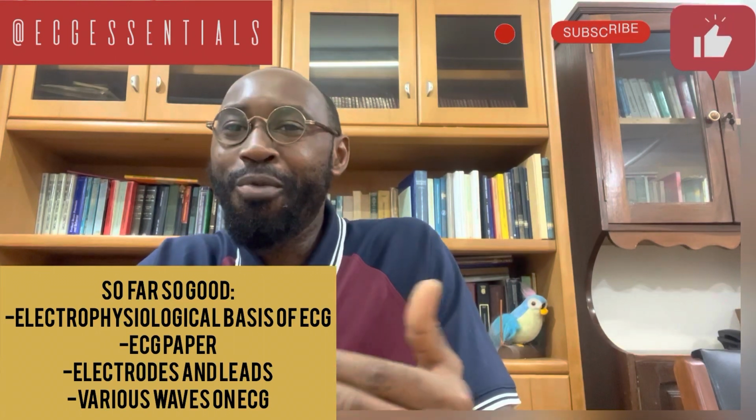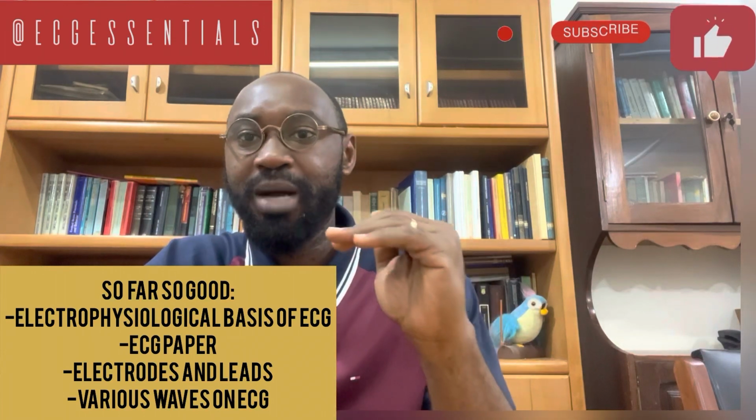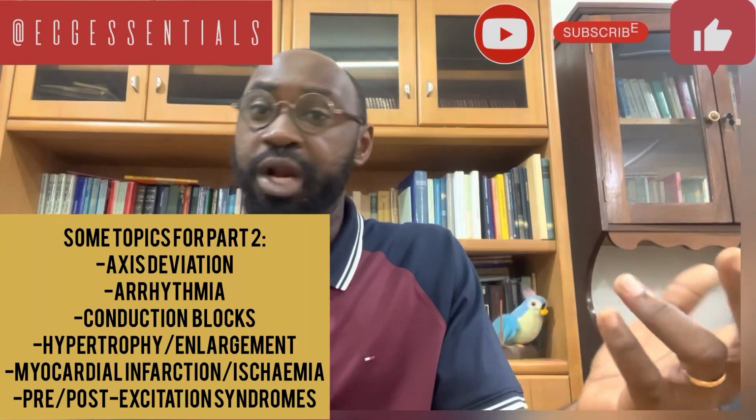And we are almost close to the second session of our discussions, where we will be looking at various abnormalities that are commonly found on the ECG, and we'll be discussing these under specific topics. So very soon in part 2, as I'm talking about, we'll be discussing concepts like axis deviation. We'll be looking at arrhythmias, both supraventricular and ventricular arrhythmias.